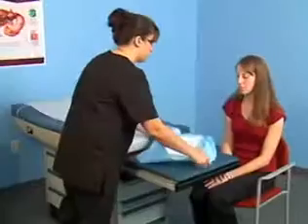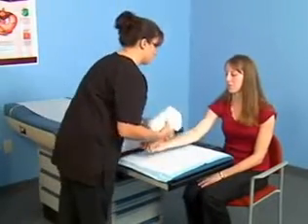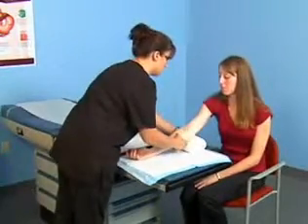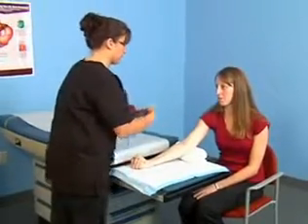Position the patient's arm to allow for easy access to the antecubital veins. Extend the arm in a straight line from the shoulder to the wrist with the antecubital veins facing you. Support the arm on an armrest, a rolled towel, or by having the patient place the fist of the other hand under the elbow.